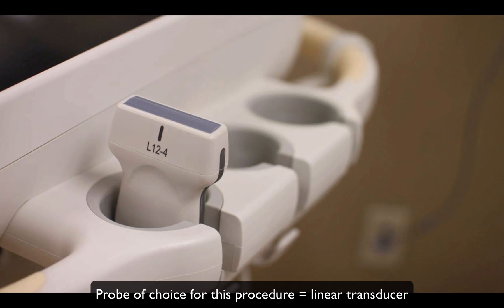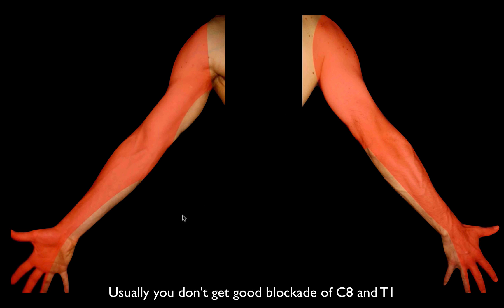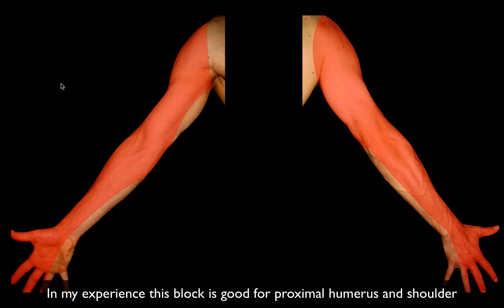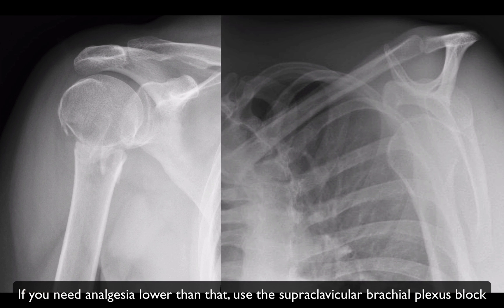Your probe of choice for this procedure is going to be the linear transducer. As far as indications, in the textbooks this is what you will be blocking — but you usually end up missing parts of C8 and T1. In real life, I only use this block for issues with the shoulder and the mid-proximal humerus. For anything below that level, I've found the supraclavicular brachial plexus block to actually be a lot more reliable.